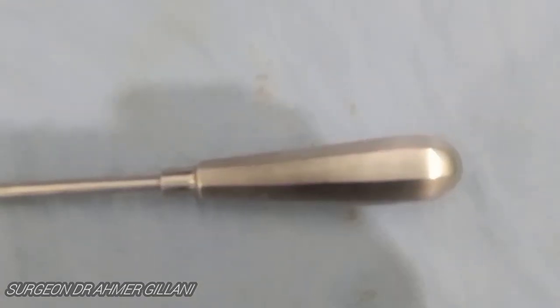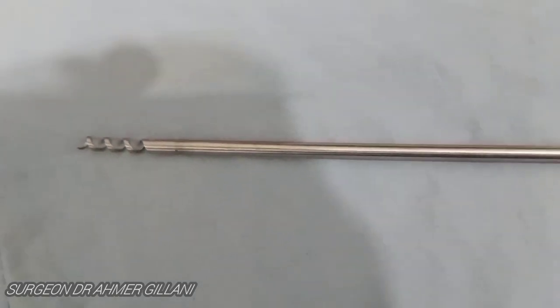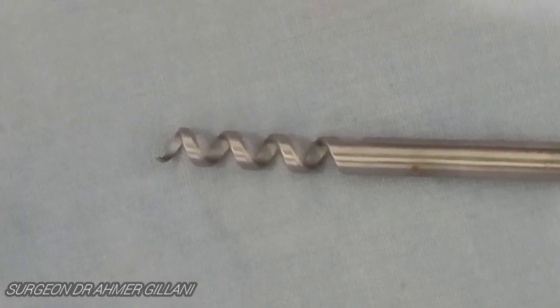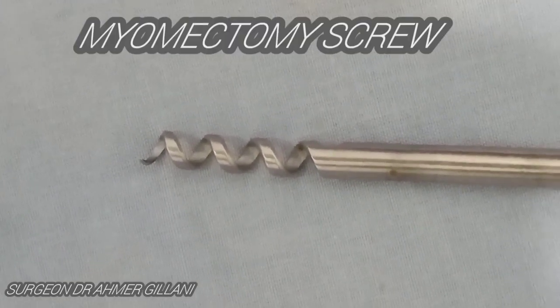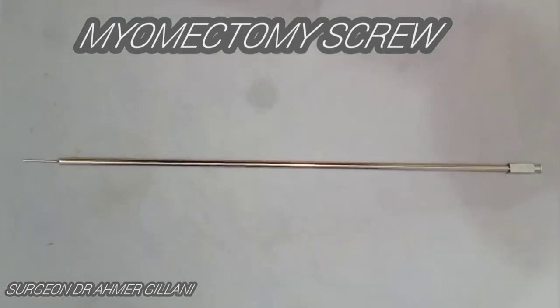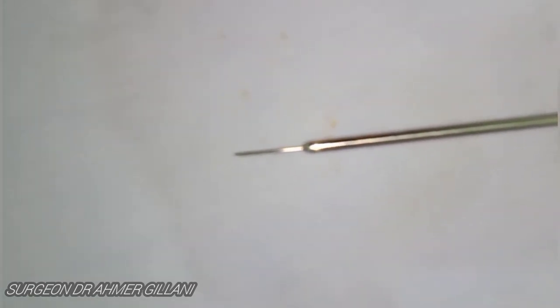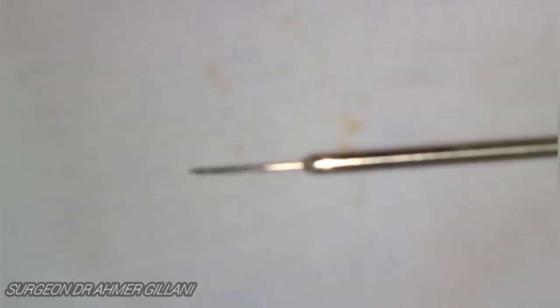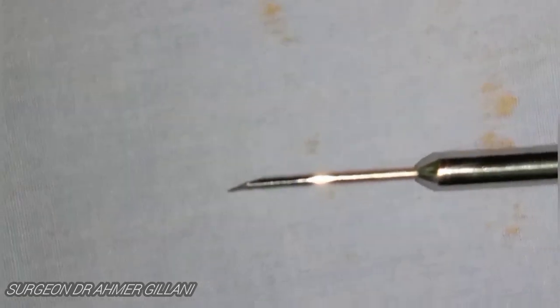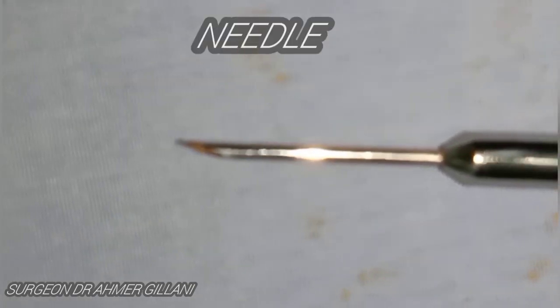This instrument on the screen is basically the laparoscopic myomectomy screw, and in close-up view you can clearly see it. This is a very basic set of instruments — not a collection of all instruments. The next instrument is used for aspiration in various laparoscopic procedures. In the close-up view it is being zoomed and focused so you can better differentiate it when it comes into your vision.